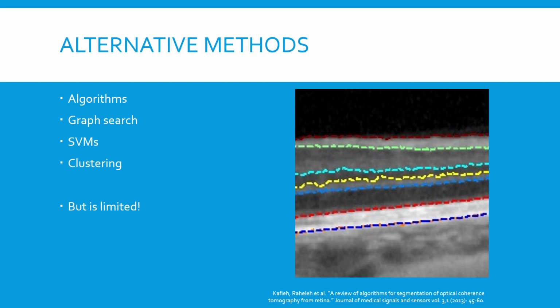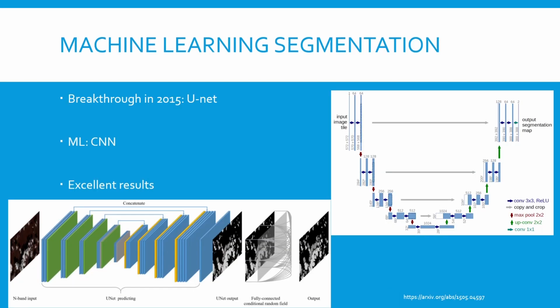However, the problems it details are that OCT images suffer from the intrinsic speckle noise problem, which decreases the image quality and complicates the image analysis tremendously. Furthermore, this is combined with the inherent messy nature of OCT images, which are prone to many different problems, such as potential fluid and blood vessels being shown in the images. So the paper concluded that no typical segmentation method exists that can be expected to work equally well for all tasks, which is quite limiting. However, in 2015, there was a breakthrough paper.